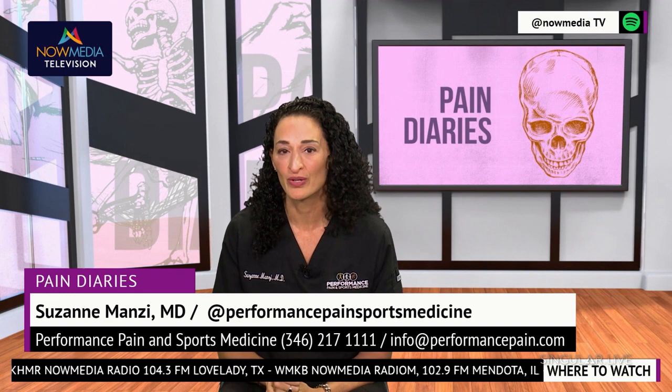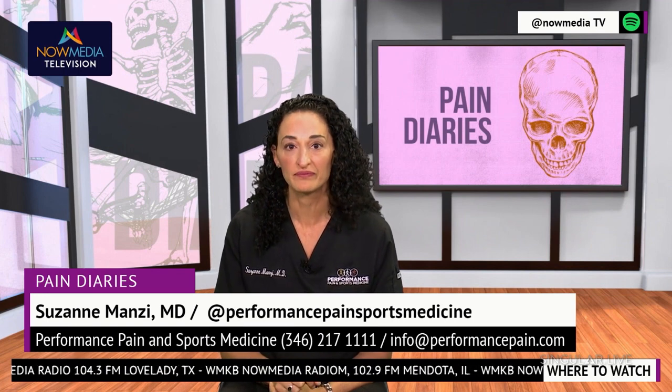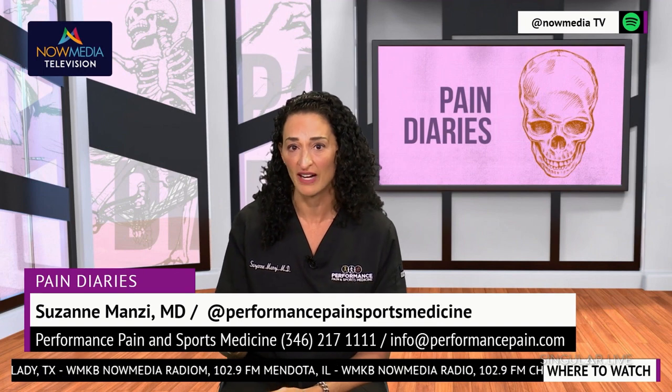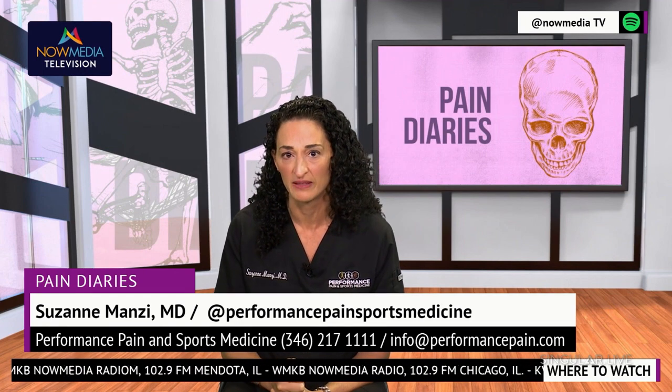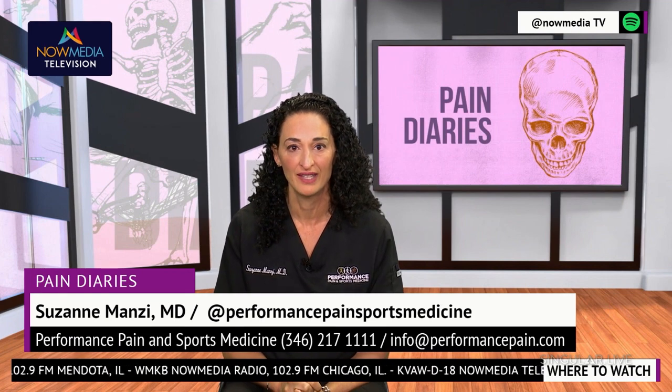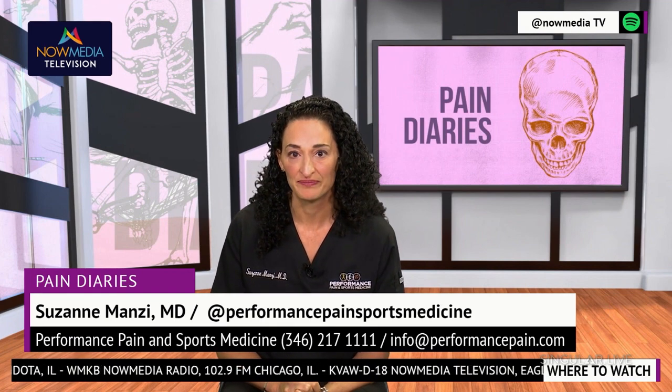Before undergoing spinal cord stimulation, patients will need to undergo a thorough history, physical exam, as well as a psychological evaluation for an implantable device to determine if they are a good candidate for the procedure. So let's talk about the procedure.